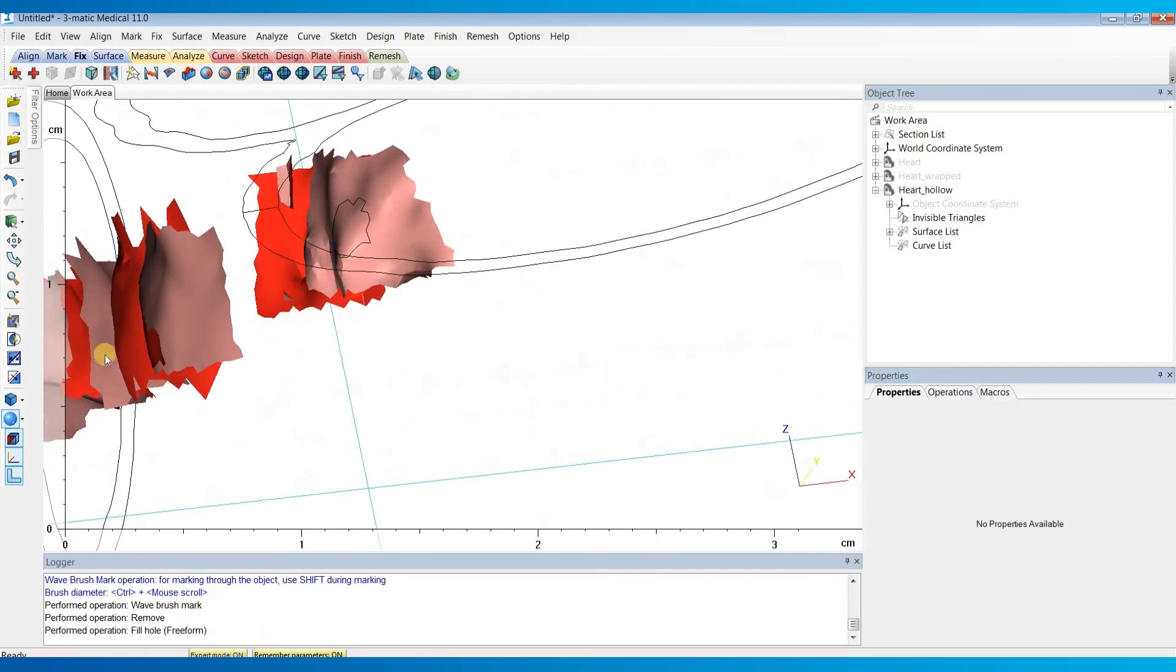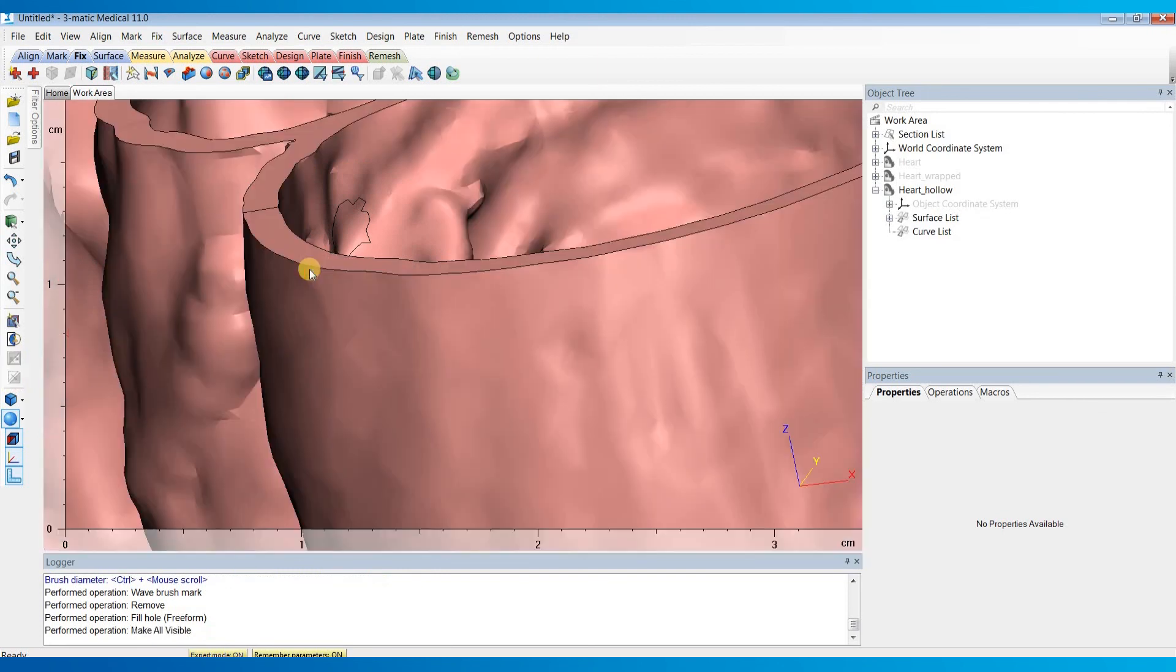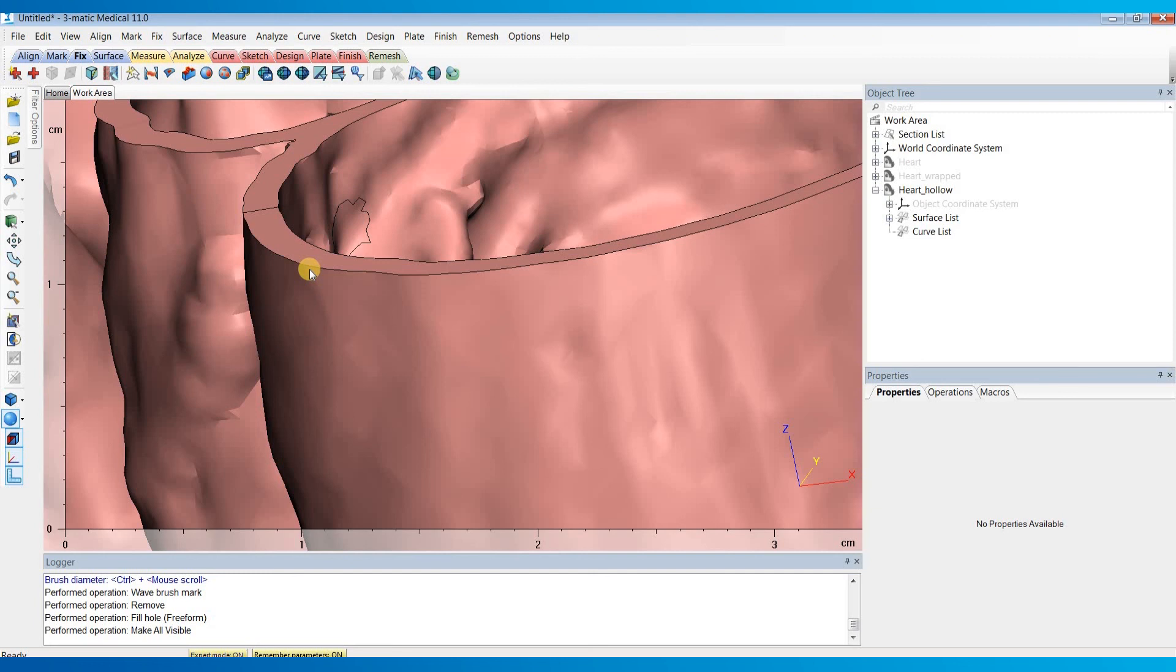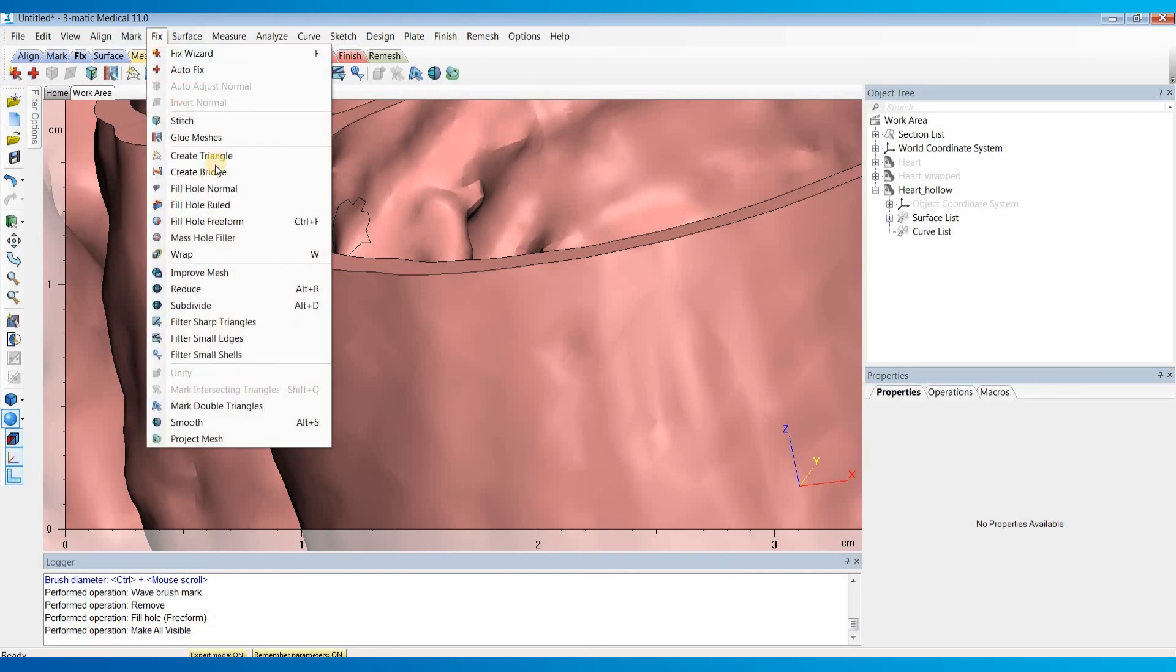You can just repeat this process for any other small holes that you have in your model. Now in some cases, the holes might be very big. And when you use the fill hole free form, it might look like the surfaces are intersecting each other. If this happens, you might have to use the create bridge tool in the fixed menu to divide the holes into smaller ones before using the fill hole free form.